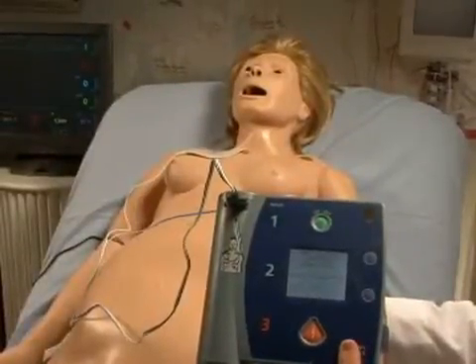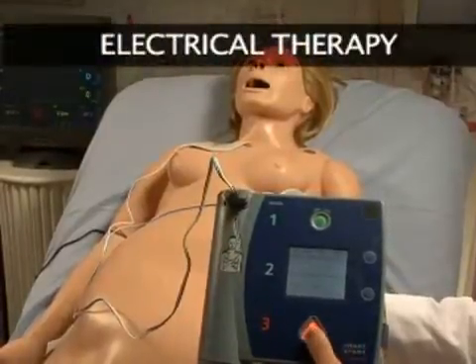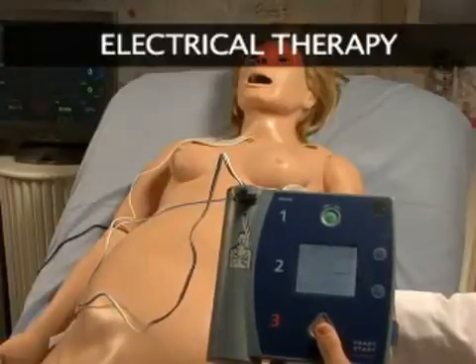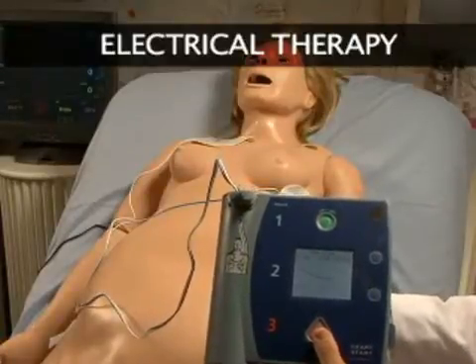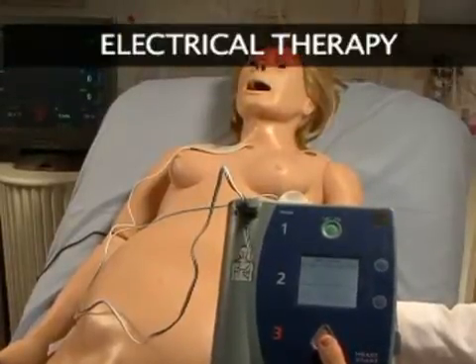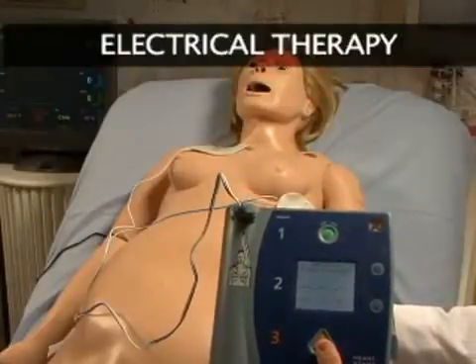To add to this realism, NOEL can be shocked or paced with real energy for cardioversion, defibrillation, and pacing drills. An AED will display NOEL's ECG, analyze her cardiac rhythm and advise action — a perfect addition to competency-based programs.